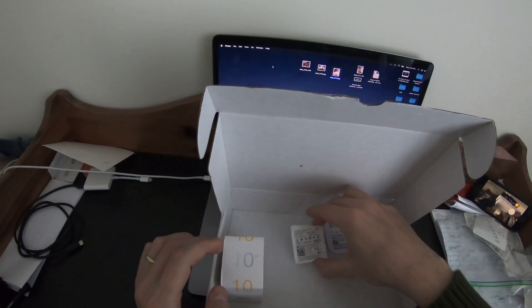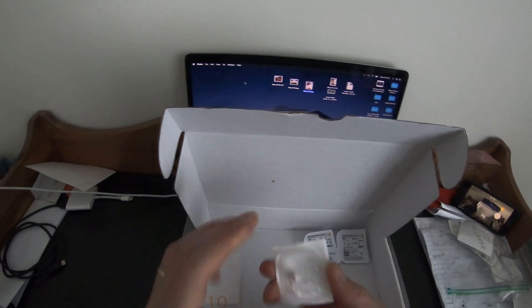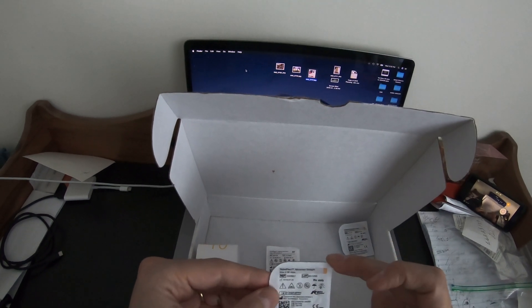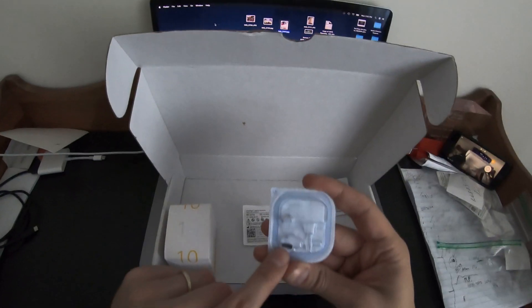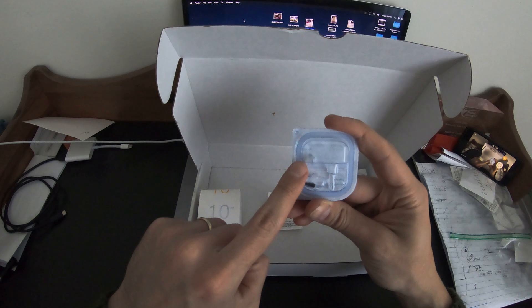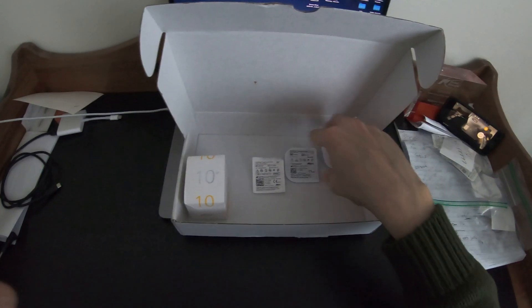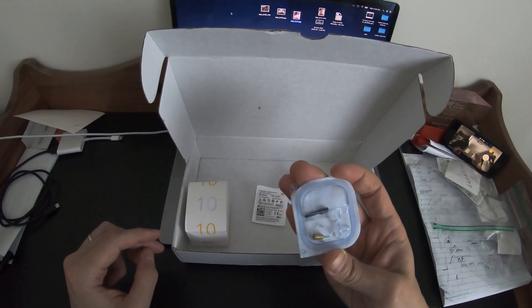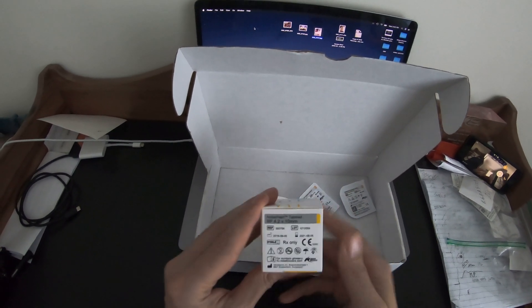We have the Nobel Pearl healing abutment, 4.2 by 3, 100% zirconia. The Nobel Pearl abutment straight internal RP, 2 millimeters — that's a fully carbon fiber screw, full zirconia abutment, 100%, and a carbon fiber screw. And then a Nobel Pearl impression coping, closed tray.